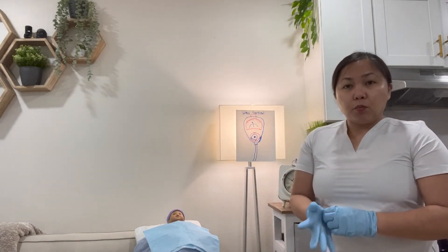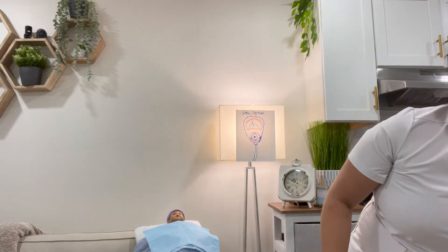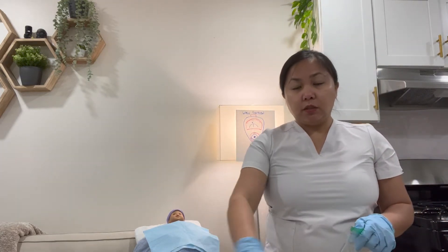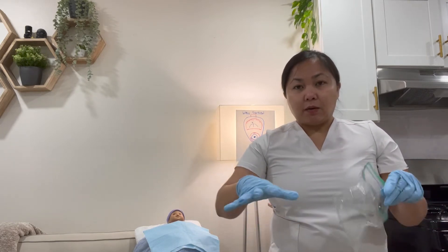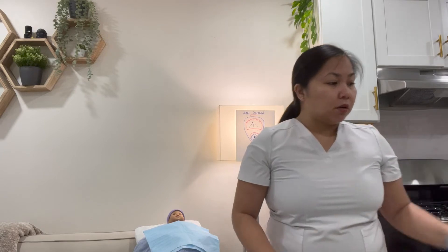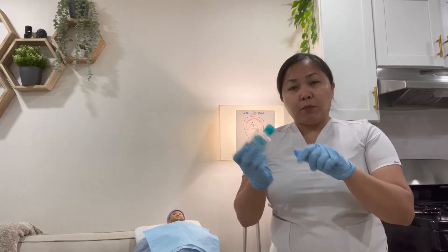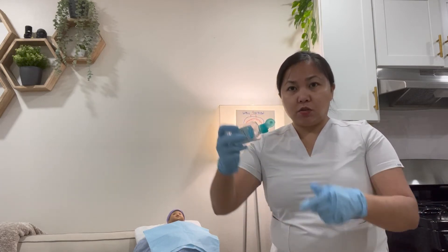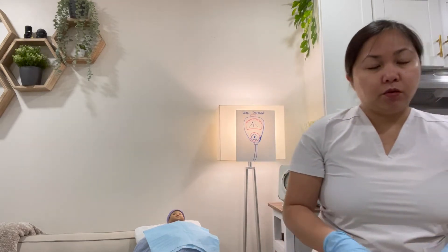Open your sterile kit and prepare a sterile field on your table, then drop the contents onto it so you don't contaminate them. Get your water-soluble lubricant and drop some onto the sterile field — don't place the whole container there, as it is not sterile.